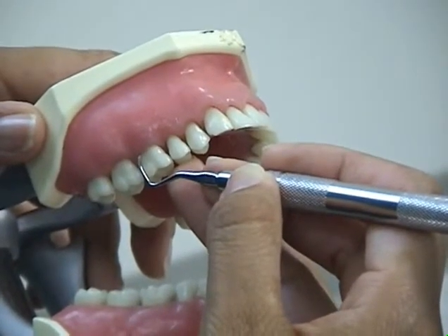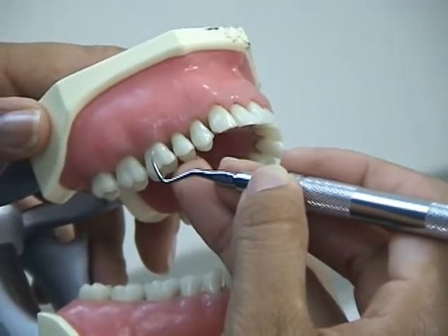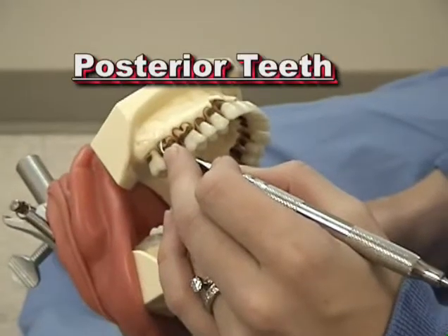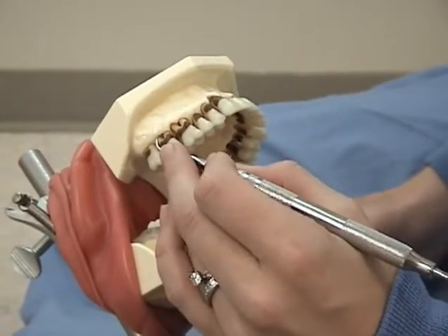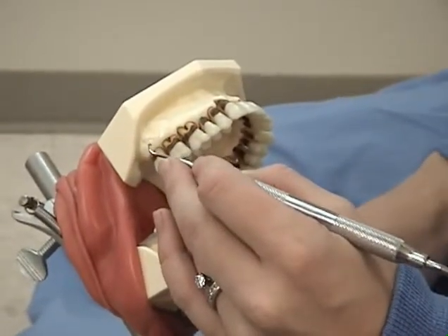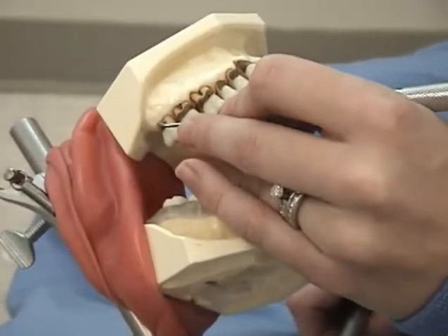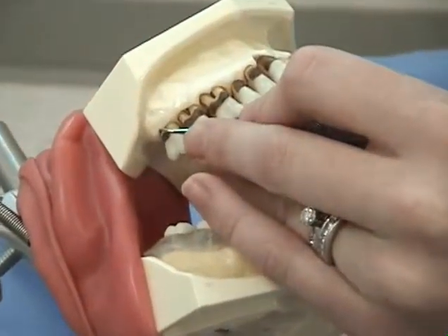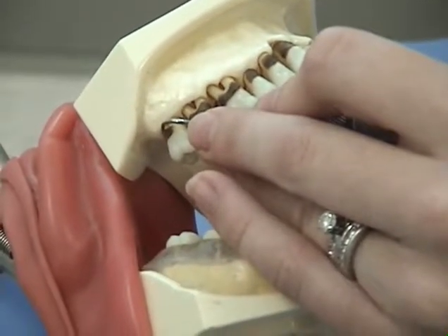The universal curette can be applied to all tooth surfaces in both the anterior and posterior sextants of the mouth. For the posterior sextant, hold the instrument in a modified pen grasp. Establish a safe, comfortable fulcrum next to the working area. Begin with the last molar in the sextant. The distal surface is completed first, beginning at the distal facial line angle and working onto the distal surface.